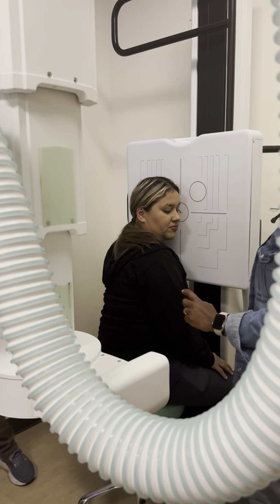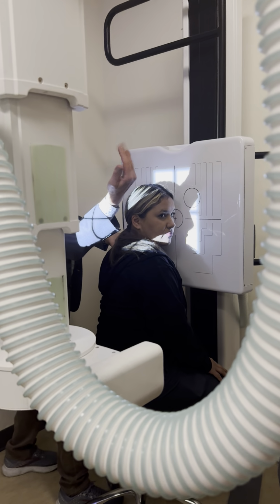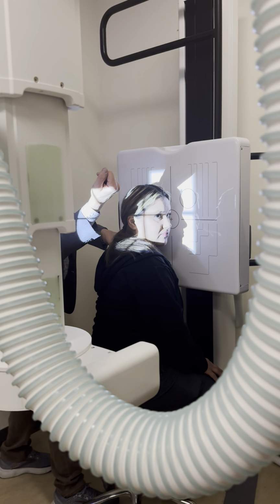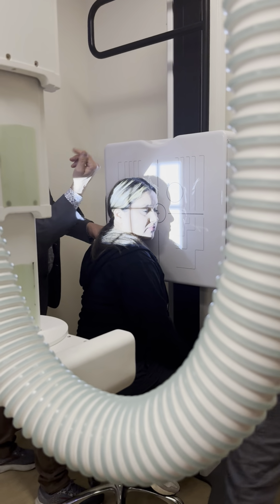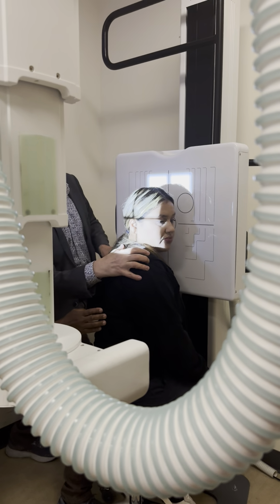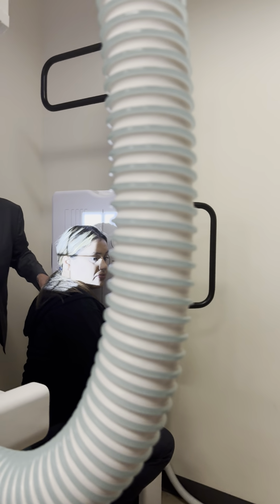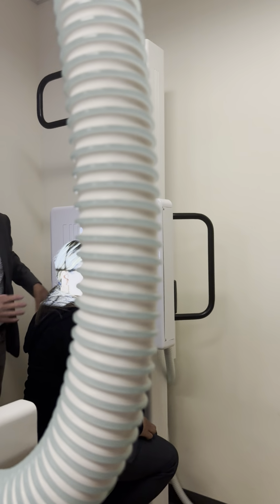Now what happens is we're gonna go 2 inches. Can you go back to that one? Mr. Hollister, I wanted a picture of the other one you just did. Come this way first, we'll get this done actually. So we're gonna go here, move her forward, at the ear hole. I don't think it was done yet. I think it's 2 inches above that line. You have to go to that line first, and then put it 2 inches up above that.